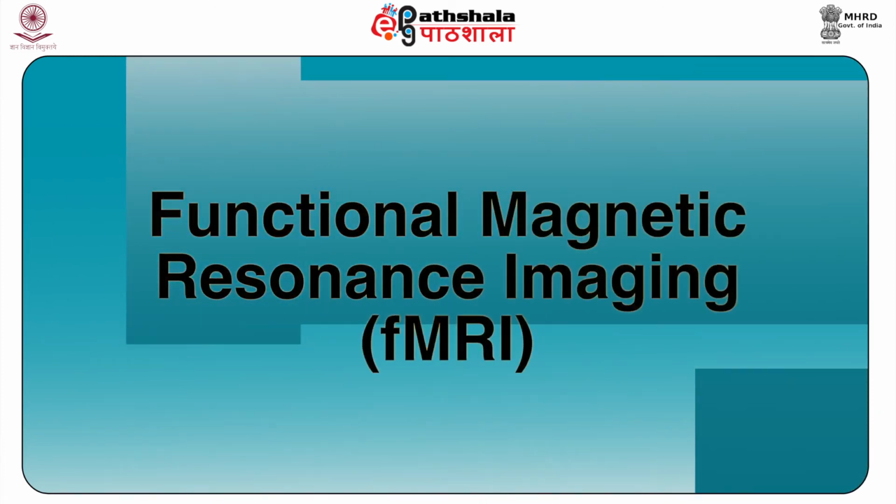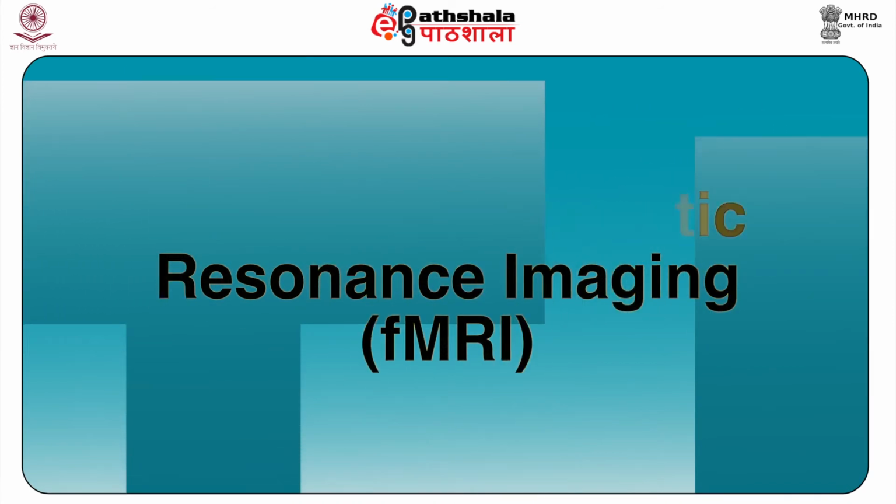Functional magnetic resonance imaging, known as fMRI. One of the limitations of MRI is that it is a slow process. Consequently, the image reveals only stationary structures. An improved apparatus called echoplanar MRI has been devised, which is fast enough to observe the blood flowing through the brain. Rapid changes in the brain activity thus can be measured through this technique.